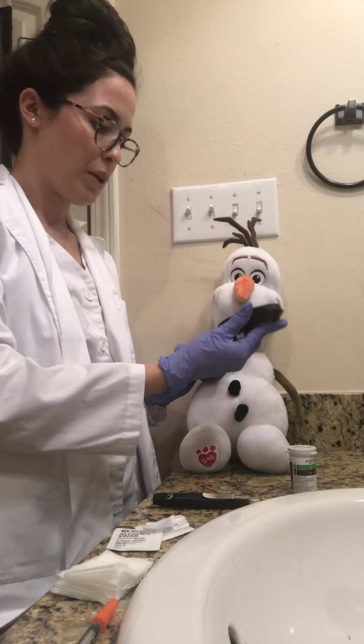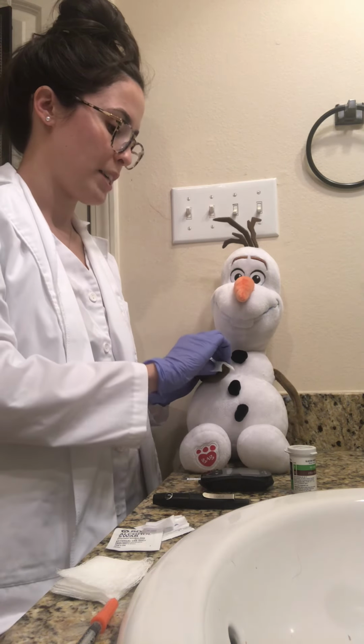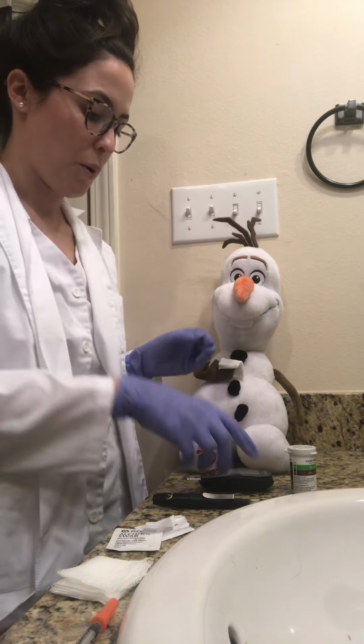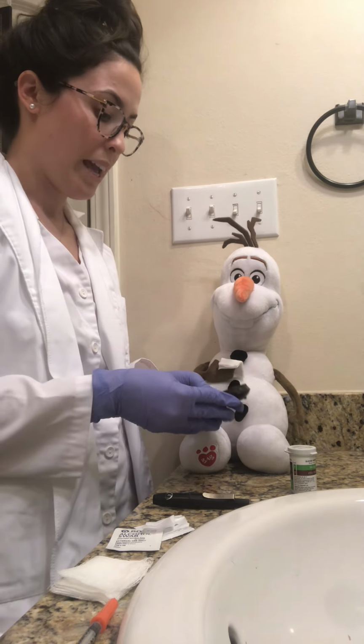All right, and we obtained his blood glucose measurement. Just be sure to give him some supplemental gauze just in case there is some extra blood that wasn't picked up by the strip there. All right, and it looks like his blood sugar is 180.